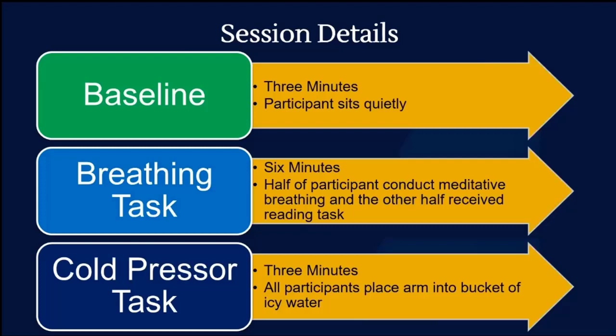After we get the baseline, in this case, we're going to induce this breathing task. The question is, what effect does meditative breathing have on our ECG? Is the meditation really necessary, or is it just the effect of the breathing that helps us control and relax, if you will? So we're going to ask half the participants to conduct that meditative breathing for about 6 minutes. And then the other half is going to be the control. They're not going to receive that meditative breathing. They'll simply do something else, again some sort of low cognitive workload, in this case a reading task.